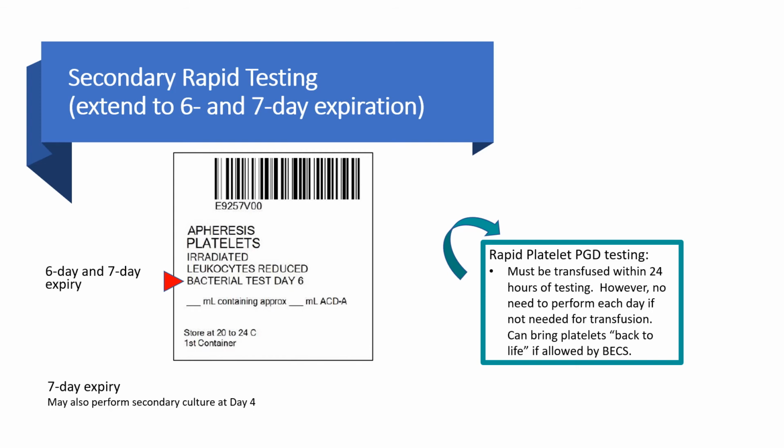Many will ask if rapid testing must be performed if the unit is not transfused within 24 hours. The simple answer is no. However, it may be difficult to bring an expired product back to life in your computer system once it has expired. I would try this in your test environment before you write that into your SOPs.